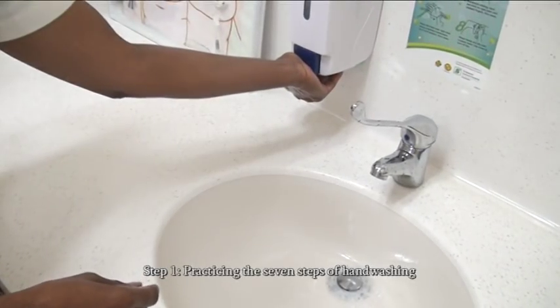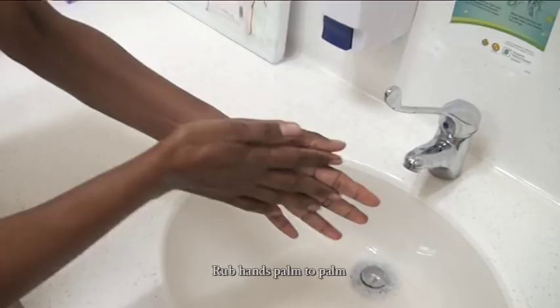Step 1: Practicing the 7 steps of hand washing. Rub hands palm to palm.